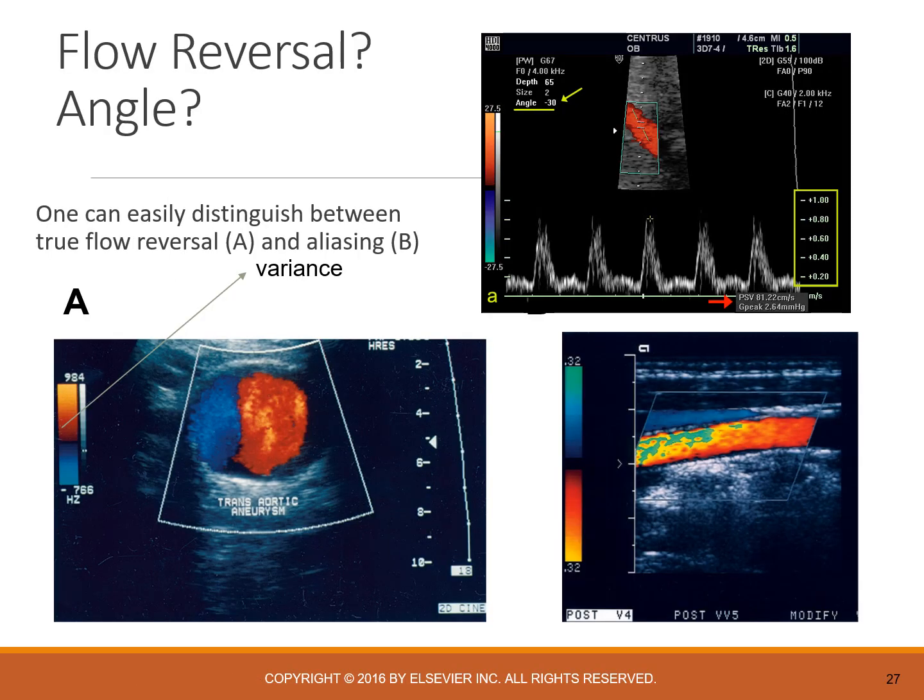One of the challenges that you can encounter if you haven't been scanning a lot of vascular is that you see something like this, where you see this split of red and blue, and you're trying to decide, do I have aliasing here, or do I really have red going one direction and blue going the other?